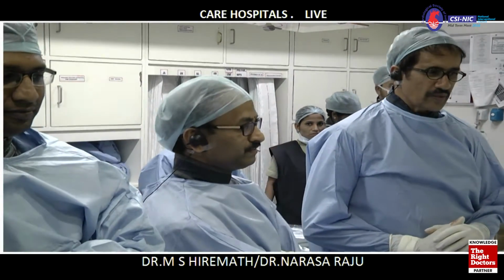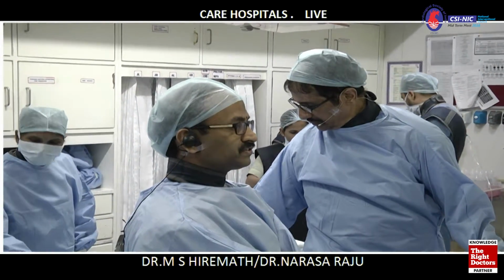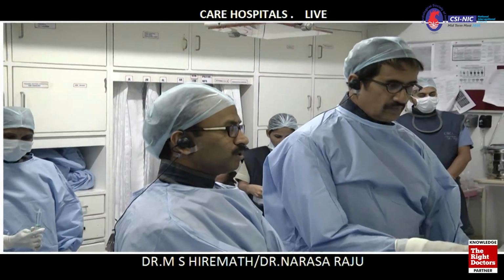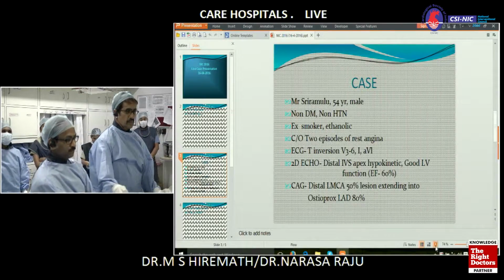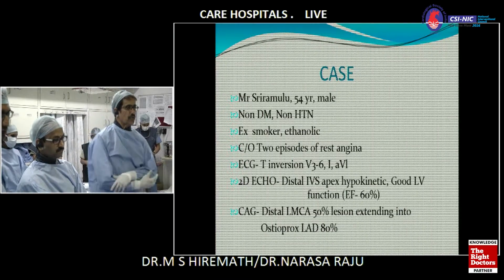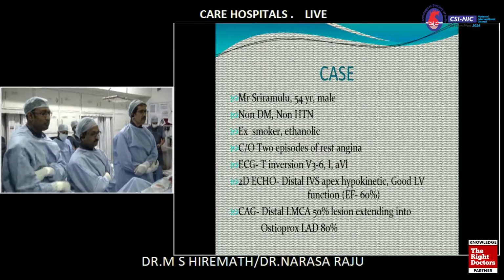Good afternoon, everybody. This is a 54-year-old gentleman with unstable angina and ECG changes in the anterior leads. His LV function is normal, enzymes are normal. So we did the angio. We'll show you the angio directly. The right coronary is normal, dominant. Can we show the cine run?